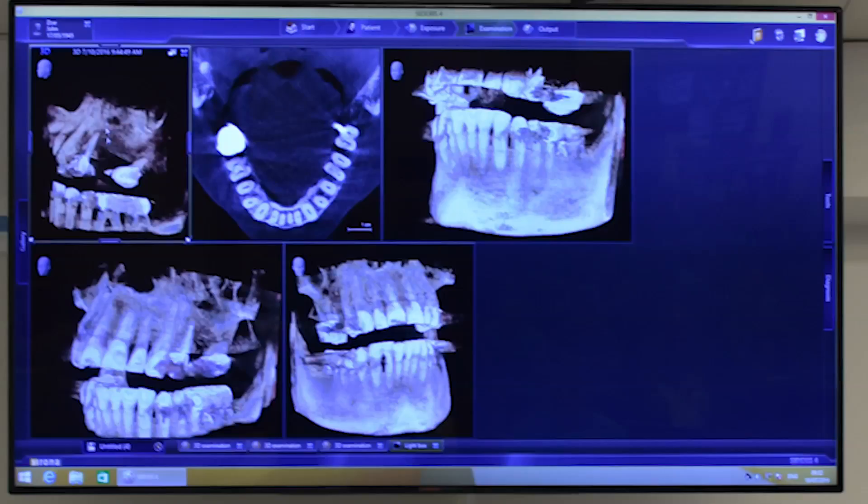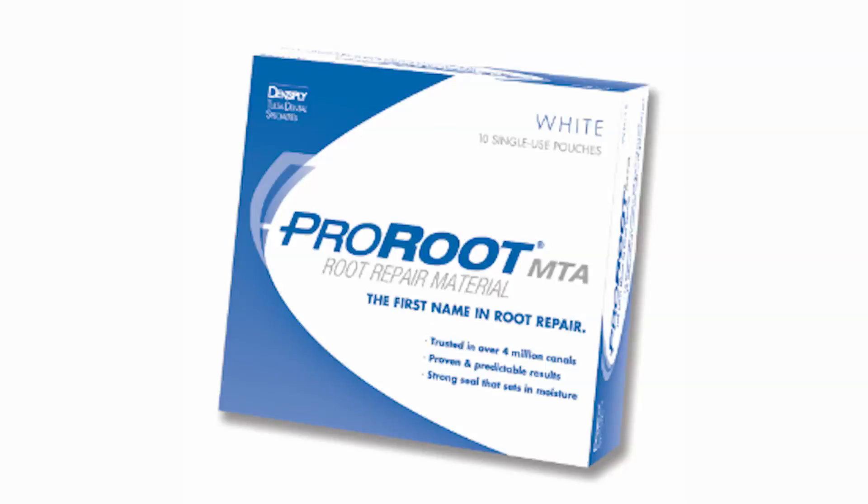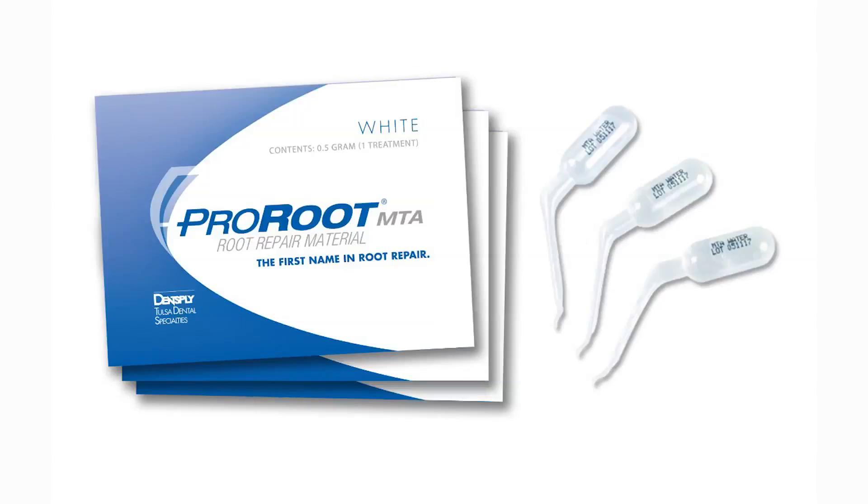The use of cone beam CT can help facilitate localization of resorptive defects preoperatively. However, if this technology isn't available, a series of angled radiographs can help determine the location and extent of the resorption. If an area of internal resorption is identified, my filling material of choice is ProRoute MTA to facilitate the sealing of the root canal system in the most biologically compatible way possible.